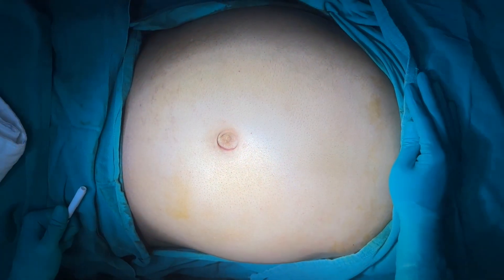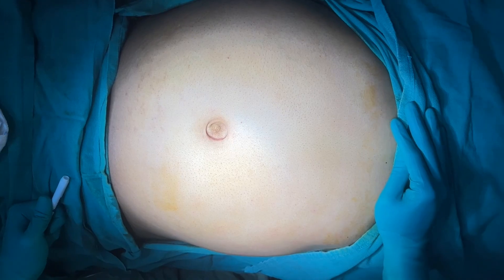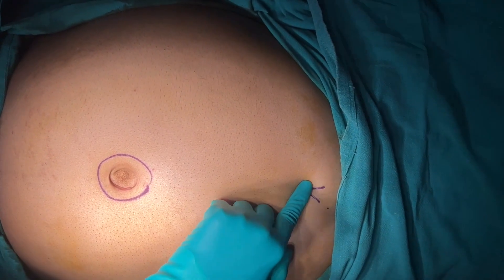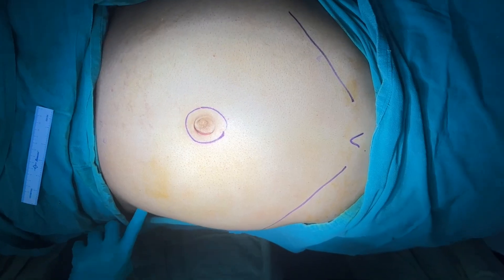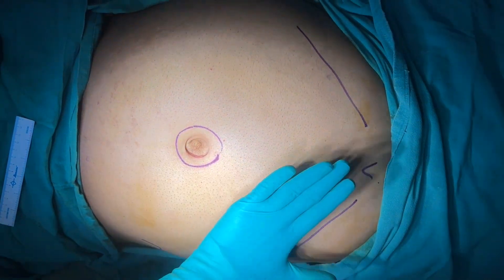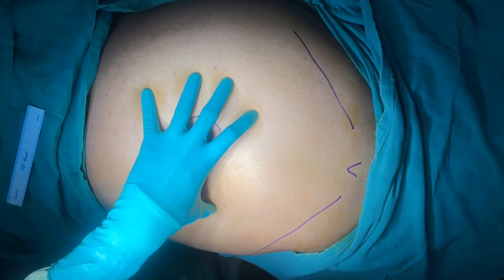This is a case of primary umbilical hernia and we are planning a robotic TAPP mesh repair. The area of interest is the umbilical defect, almost two centimeters in size. Landmarks include the xiphoid, pubic bone, and costal margins on either side. The patient is in supine position and the plan is to insufflate the abdomen from Palmer's point using a Veress needle, after which we will mark the area of interest.